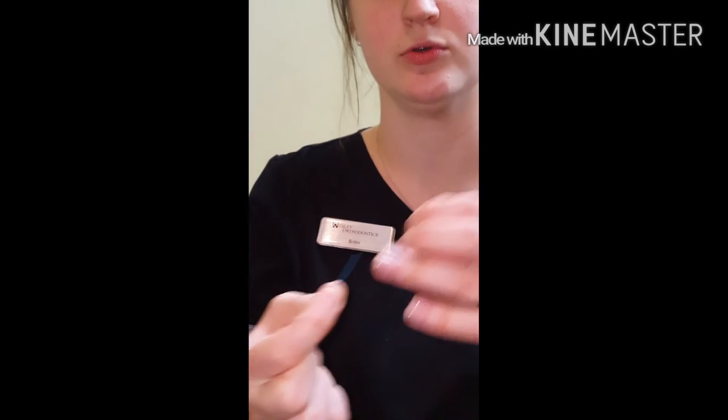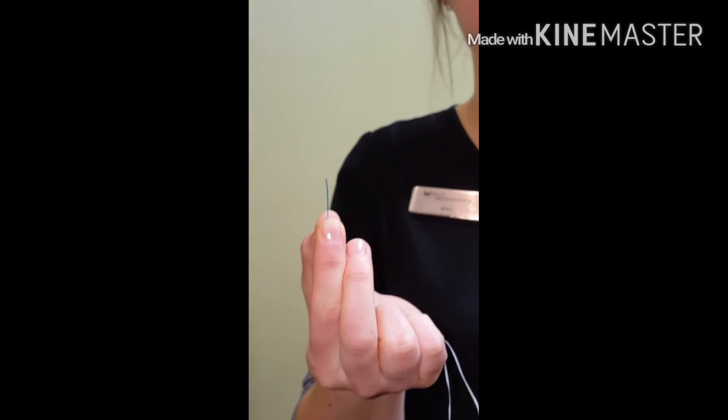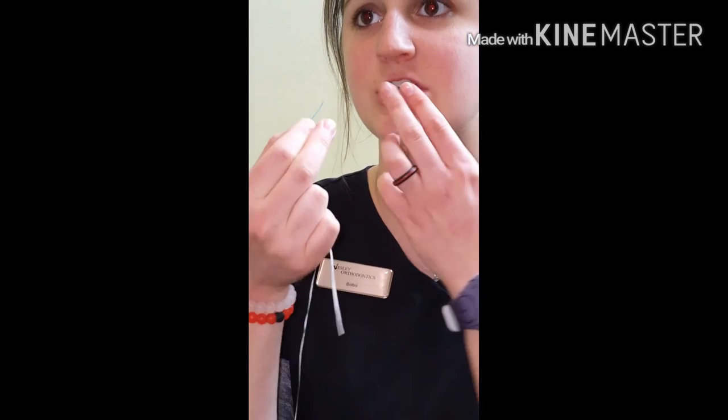The next thing you're going to have to do — I'm going to explain it and then show you — is take your floss threader, find the V-point in your gum, and kind of wiggle the threader through until it will feed all the way through to the other edge.